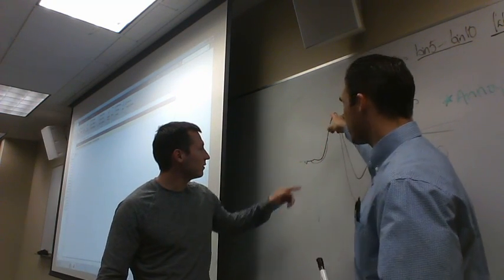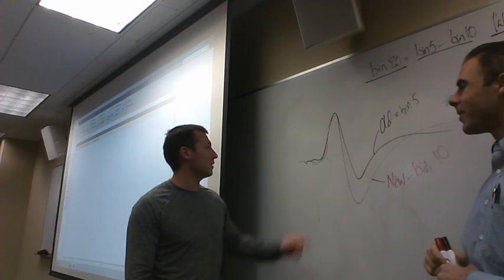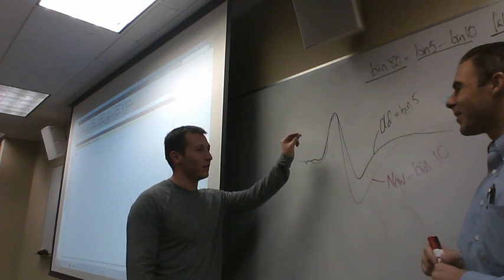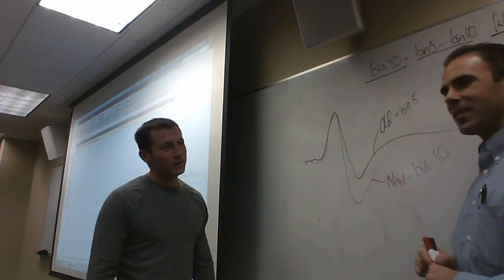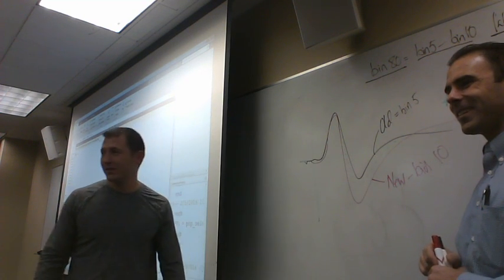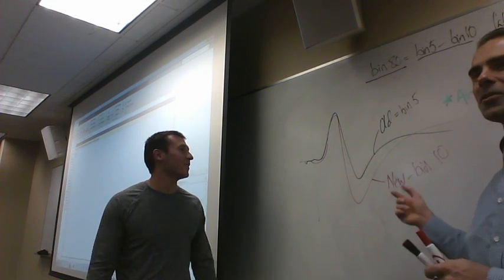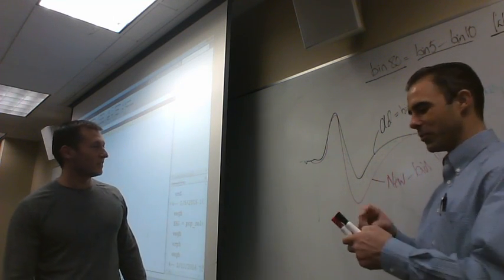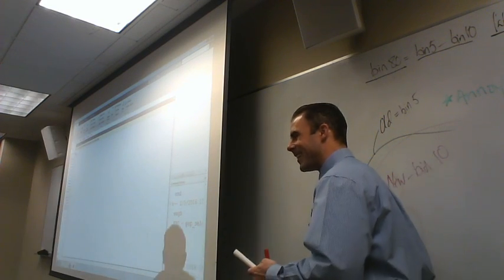Then why is the green line going up? Unless they're absolutely touching, which I don't know if they are, but I see the spaces here. The value between the spaces is like 0, so it should be flat. Yeah. Oh, okay. Let me show you how I would fix it up, because of how it would actually look.